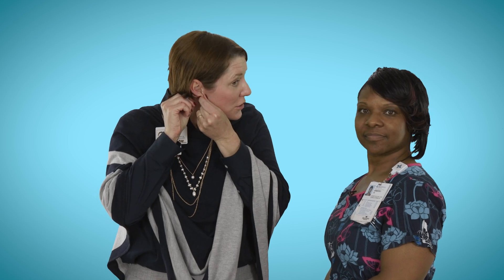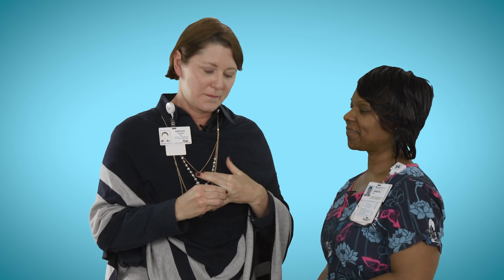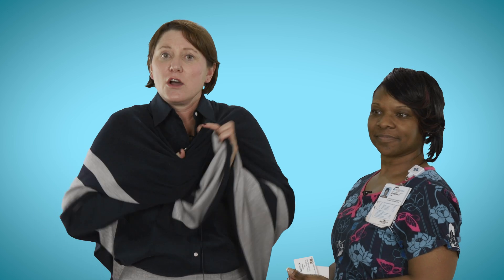Employees can put on PPE by themselves without a buddy. It is important to remove all your jewelry — remove dangling earrings, rings, and necklaces. You want to remove anything and everything that could potentially cause an exposure. Your name badges need to come off. Also, any loose clothing such as scarves, sweaters, scrub jackets, and anything else that is loose and could cause any kind of potential exposure.